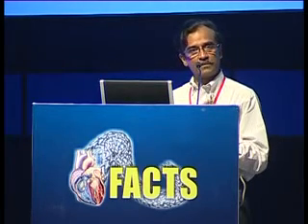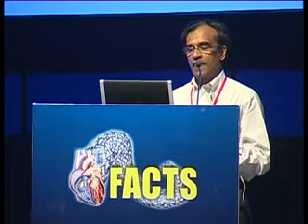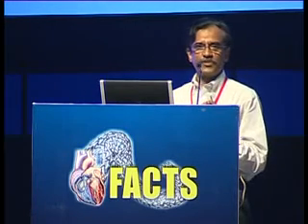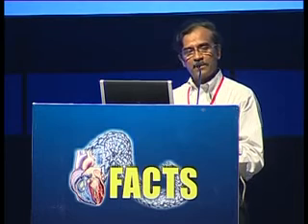Mainly when performing the procedure, sometimes we may encounter resistance at the groin side, difficulty in maneuvering the balloon catheter across the atrial septum, placement of the balloon catheter in the left atrium, and navigating the catheter across the stenotic mitral valve. And in the end, some of the balloon impressions may give a clue to the possible complication of mitral regurgitation. So I'll go through one after another.